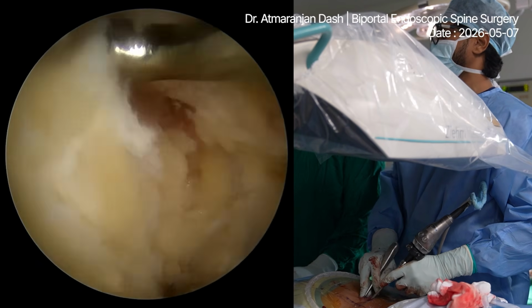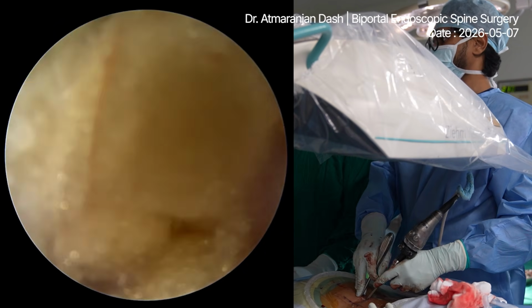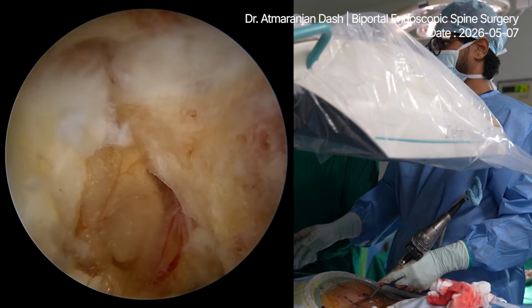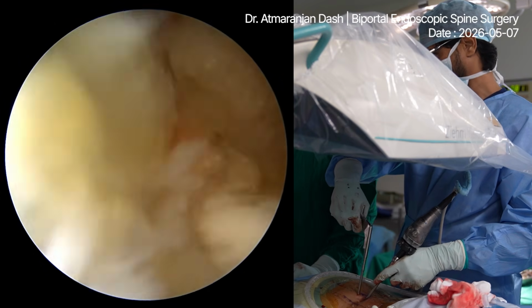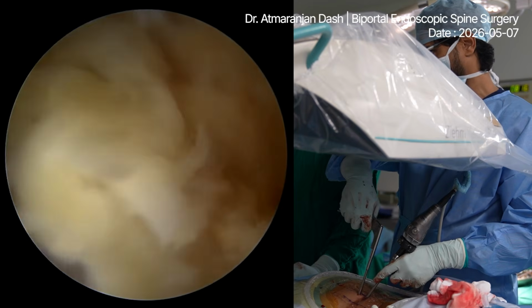I am lifting. I call it an orange peeling mechanism, to peel the orange. Harrison, please. So below it, you see the problem in these cases is the overriding, which is a normal phenomenon at L5S1 level.